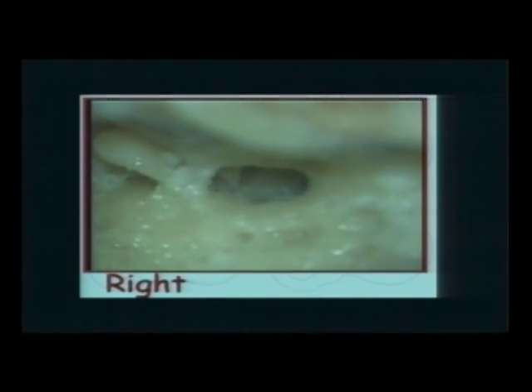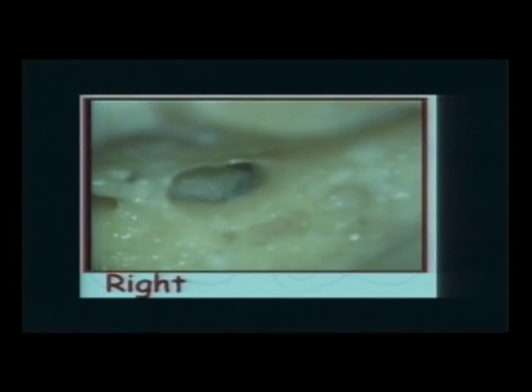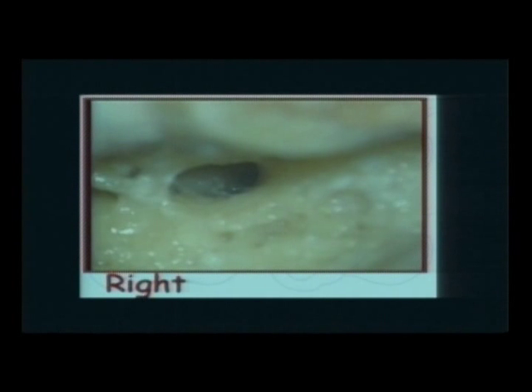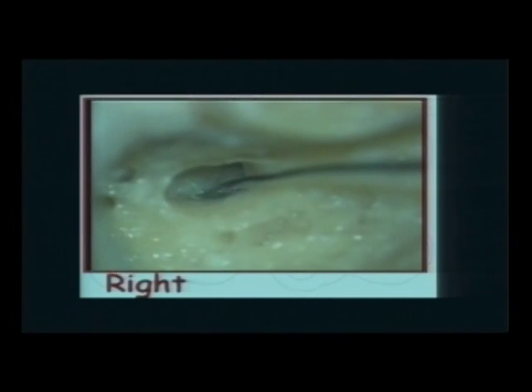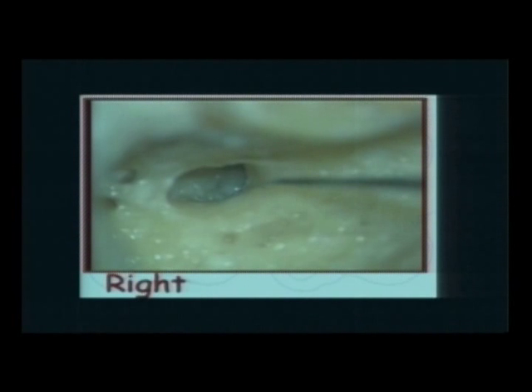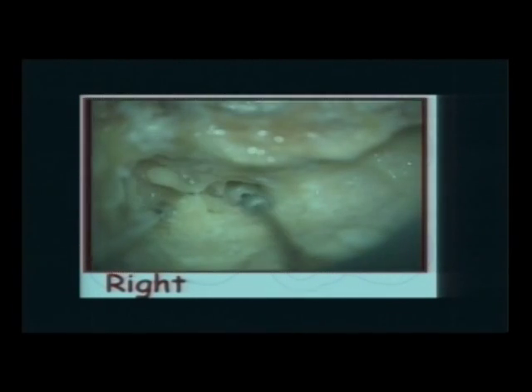When you dig up your bone, spend time. There's a shadow down there because I didn't drill this part of the canal wall myself. I have to thin it out so that I can bring light into the middle ear. This is the round window. And I've stuck my needle into the niche. And there's the hypotympanic air cells calling on you. There's Jacobson's nerve. And anteriorly right there, you're going into the eustachian tube.